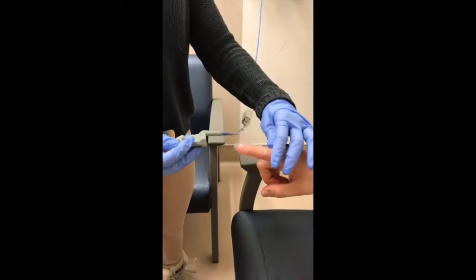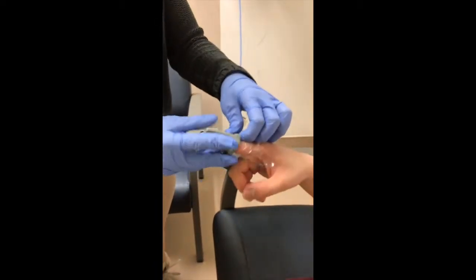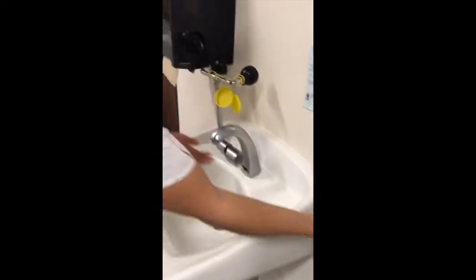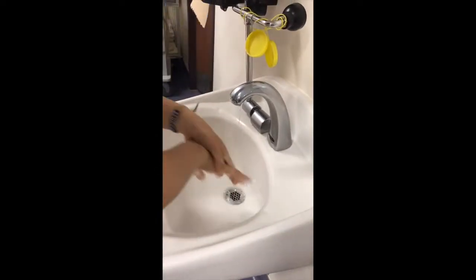Next, insert the pulse oximeter onto the patient's finger. Please note to wear gloves during this step if you are going to be in contact with blood or bodily fluids. After cleaning each piece of patient care equipment, be sure to remove gloves and perform proper hand hygiene.